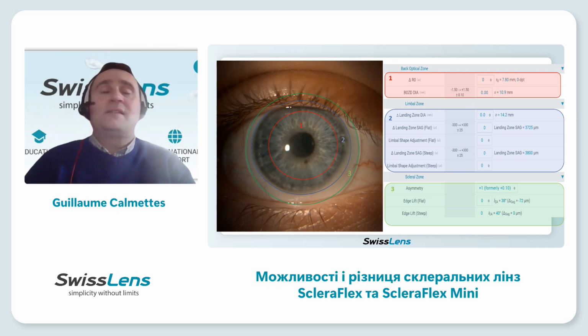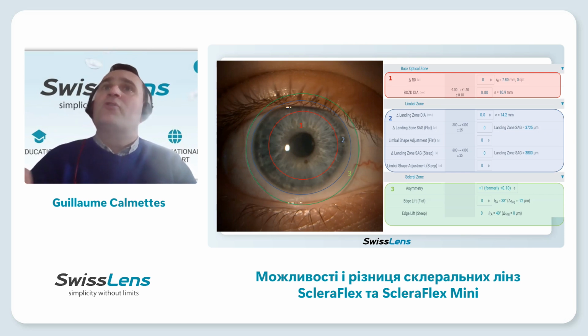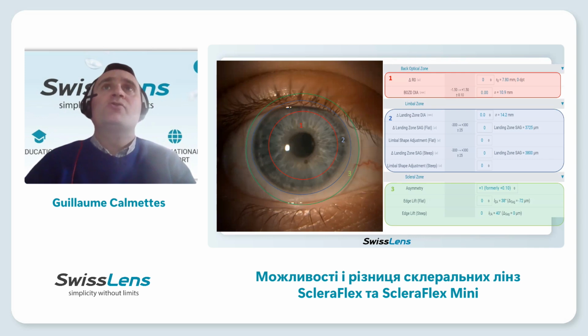This option is a little bit complicated, but I will show you, and on our website you can have access to the designs so you can understand a little bit more. The technical services is also here to explain and to show you the difference between each option of each limbal zone, or what is changing. For some cases, we need to change the sagittal or the diameter. So it's something you need to understand a bit.